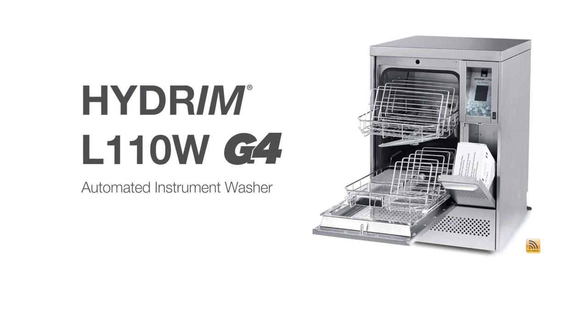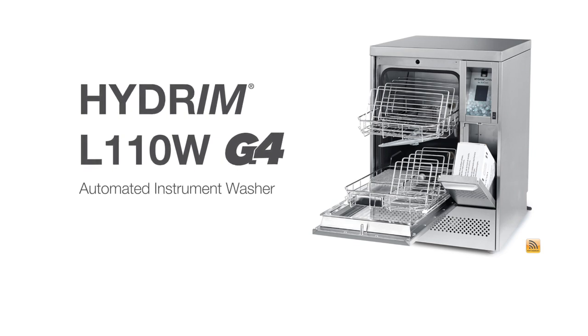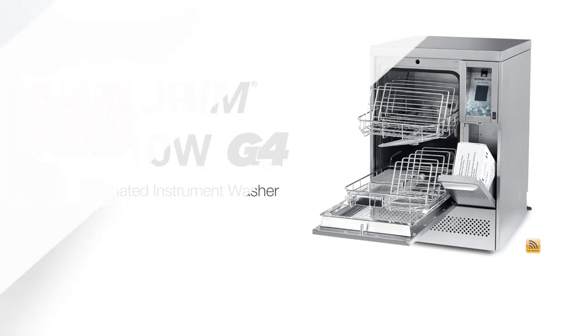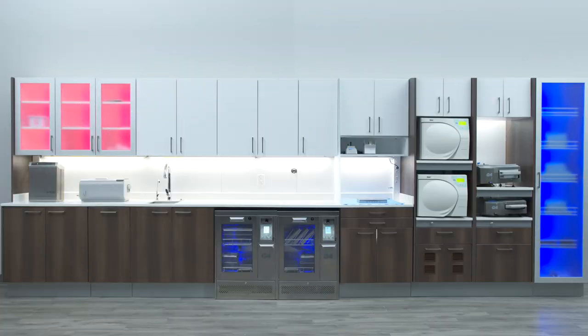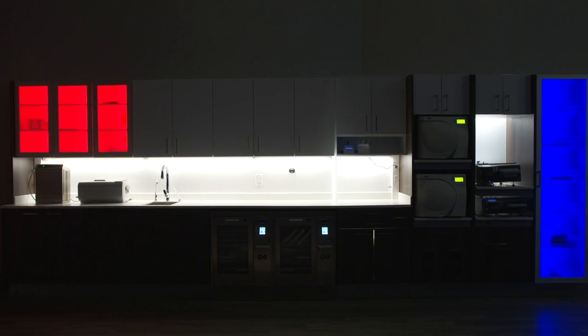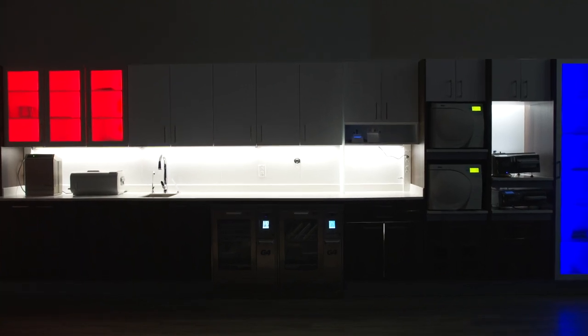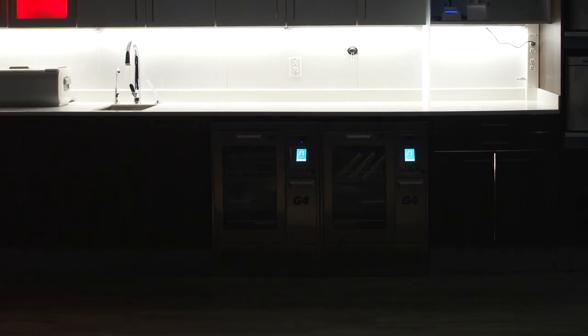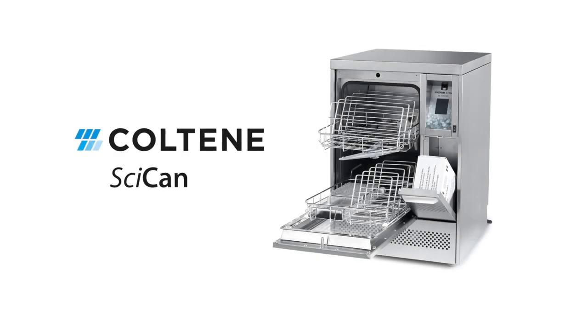You can find more features and options in the operator's manual that make the washing process easy and efficient. Never turn off the Hydrum — always leave it turned on for additional safety reasons. Thank you again for choosing SciCan as your infection control specialist.